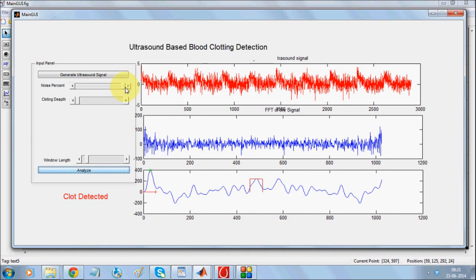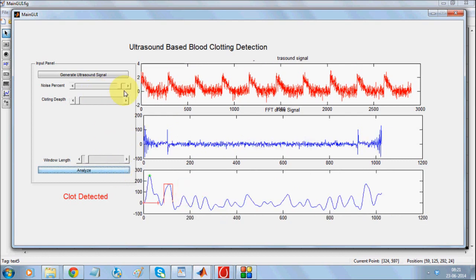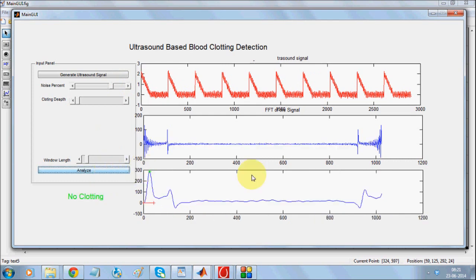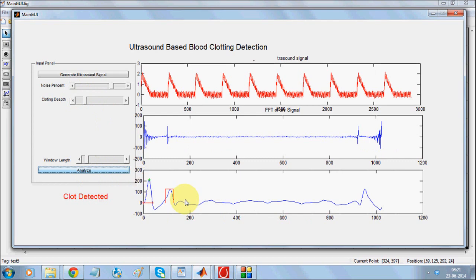Too much noise introduces significantly higher frequency bands in the signal — subsequent bands — causing the system to consider that a clotting. When the noise is a little lower, it detects properly. And as and when you introduce the actual clot signal, it detects it properly.